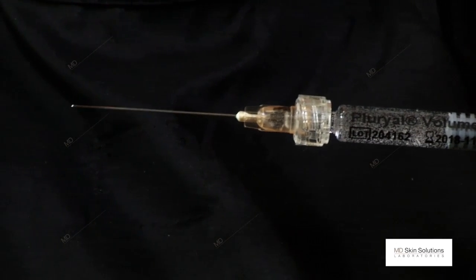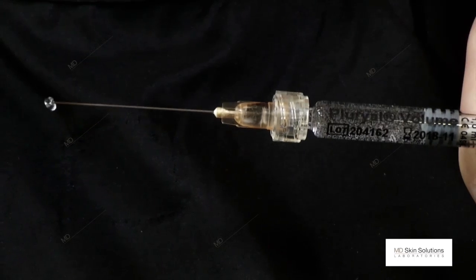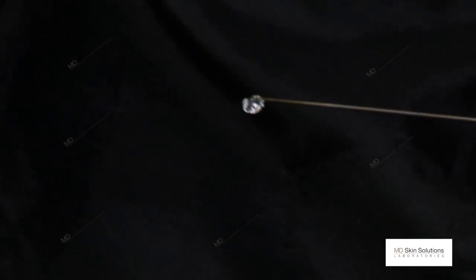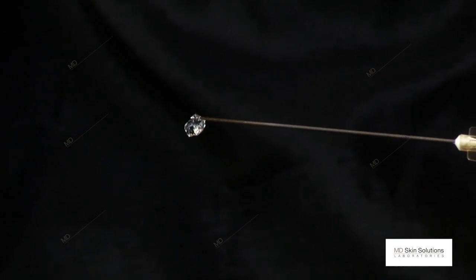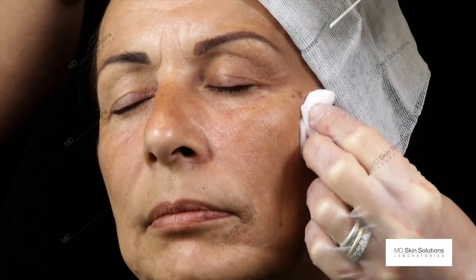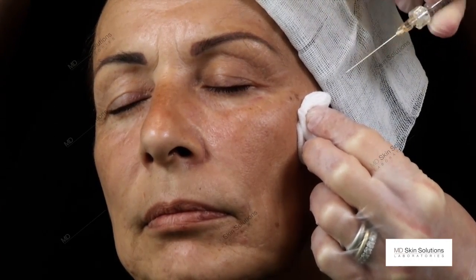Next rule is to prime the cannula, never inject air. And you see how viscous the product is. It's a volumizing hyaluronic acid, Pluryal Volume. It stays where I extruded it from the cannula's tip. Next trick is I hold the syringe like a screwdriver.